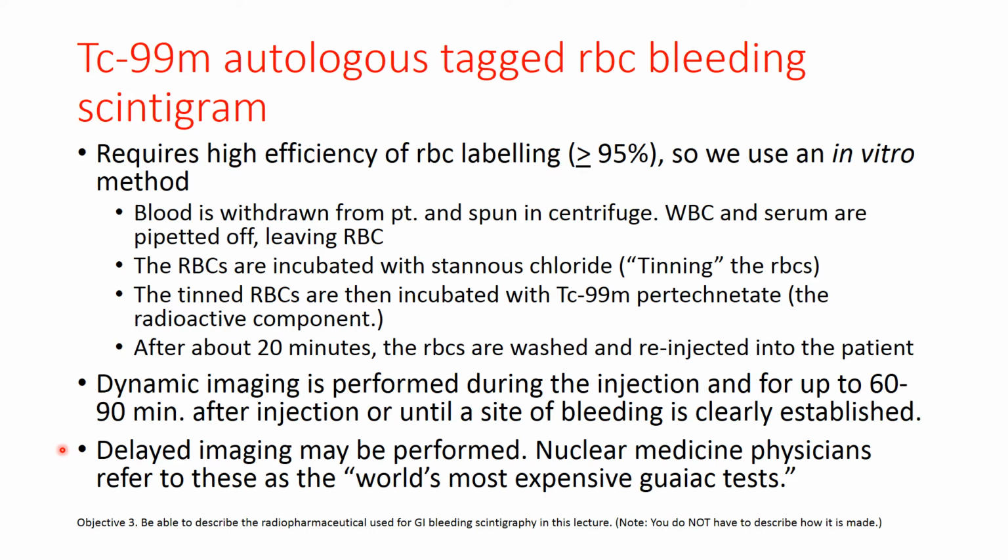They have another bloody stool. 12 hours later, 24 hours later, we can bring the patient down and re-image them. The problem with this is that we are looking to guide the angiographer or the surgeon as to the location of this bleed. If we do these delayed views, generally what's happened is that bleeding has already gone throughout the bowel. It's collected in the dependent portions of the bowel, or the portions that are lowest when the patient is lying down, and we have no clue where the bleed came from.